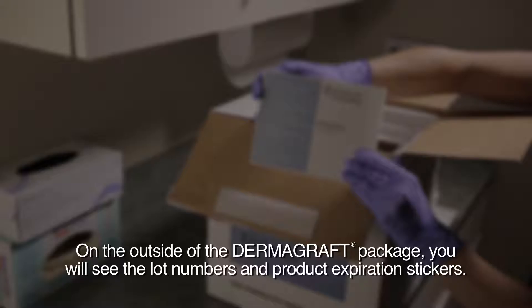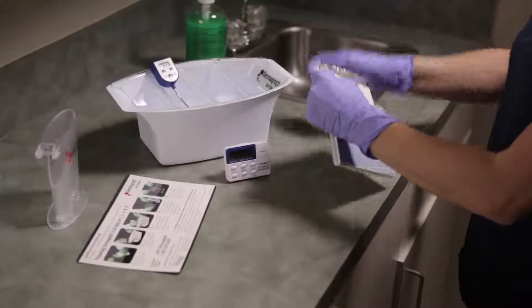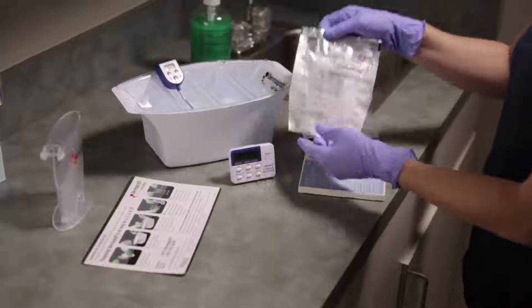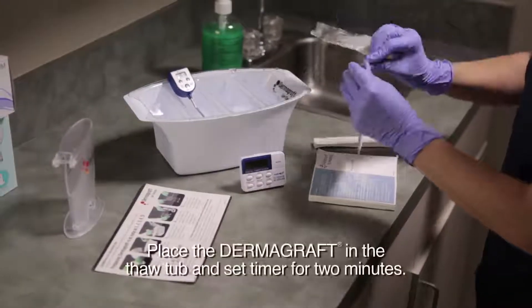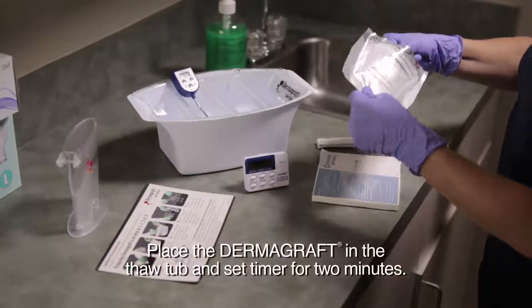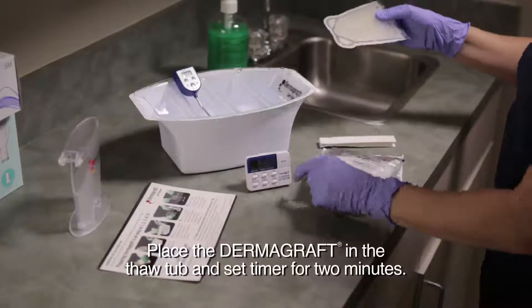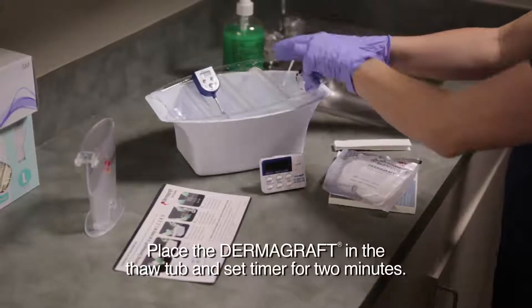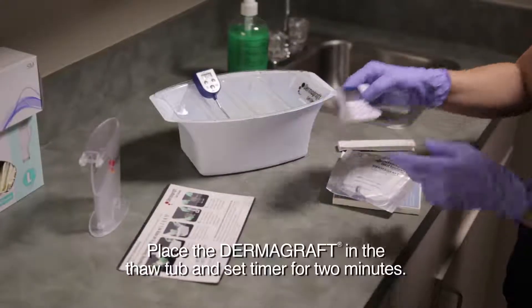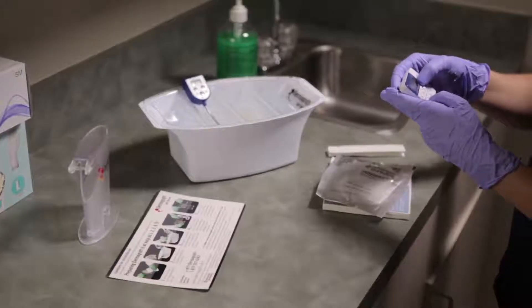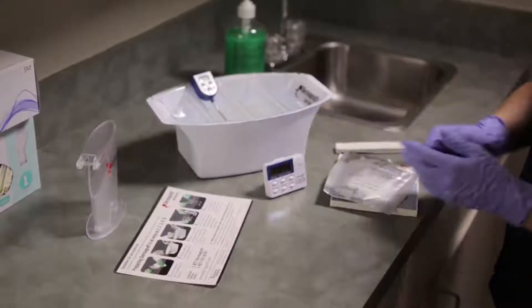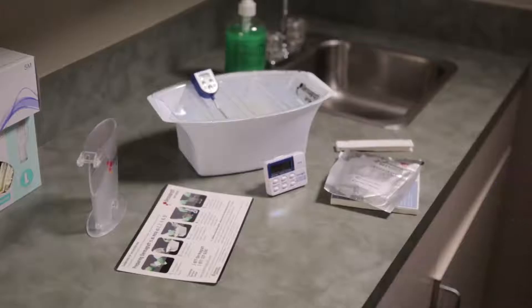Note that on the outside of the Dermagraft package, you will see the lot numbers and product expiration stickers. These should be placed in the patient chart or any other tracking tool preferred. The foil pouch should not be cut open but rather torn to remove the actual Dermagraft. Place the Dermagraft in the thaw tub and set the timer for two minutes. Only a single piece of Dermagraft should be thawed at a time. During the countdown, ensure you have normal saline at room temperature and a sterile pair of scissors ready for the next steps.